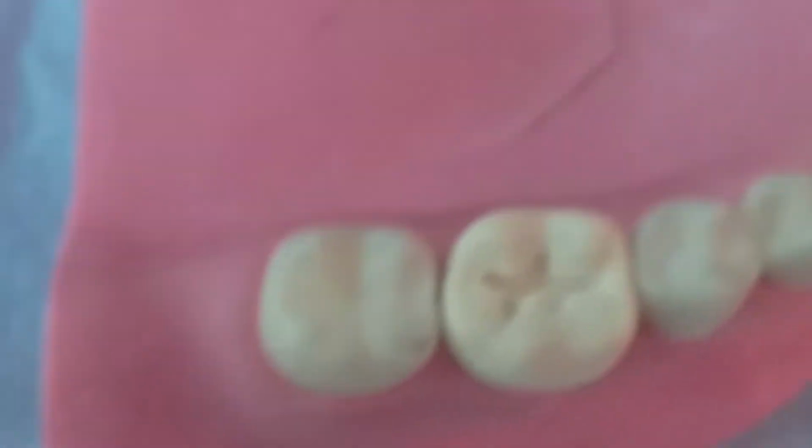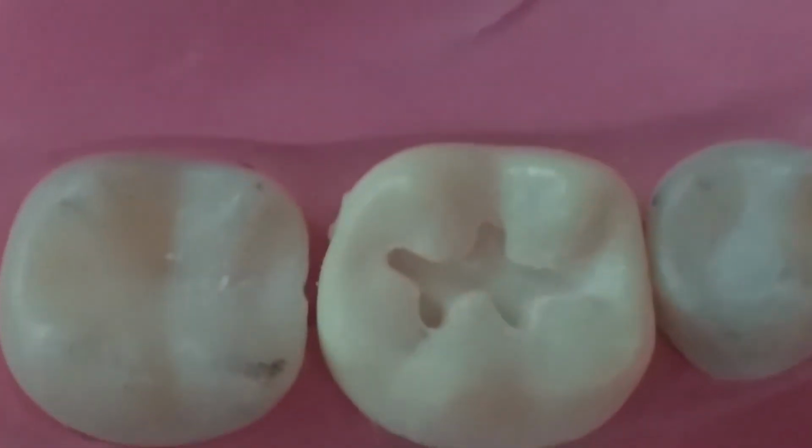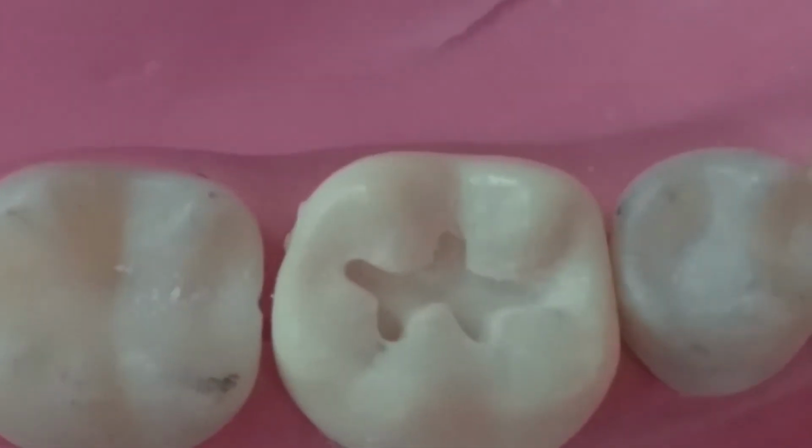And here we finished. Take a look at the shape, depth, width. Thank you and good luck.